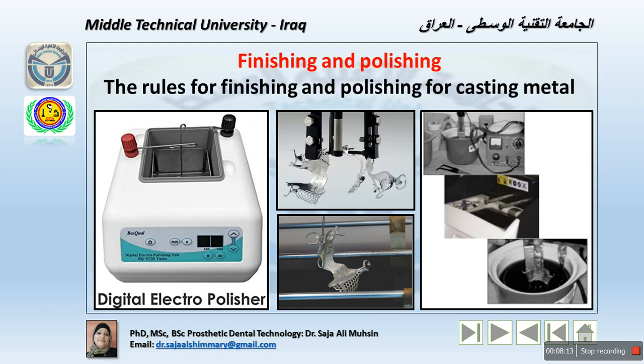The basic principle of the polishing is to remove scratches with finer scratches until the final stages, when an amorphous layer is formed on the surface by the action of the finer polishing agent. Now, the polishing is the same as the procedure with the polymer materials, but still the tools and the felt wheels are different. The polishing steps are completed sequentially over the entire polished surface. This prevents repetition of polish.